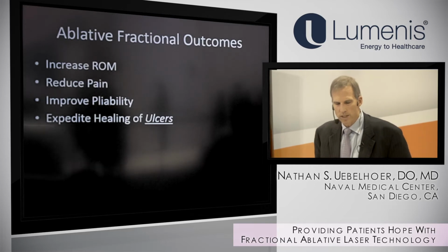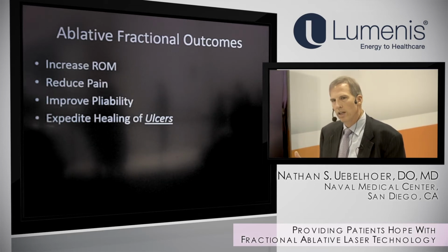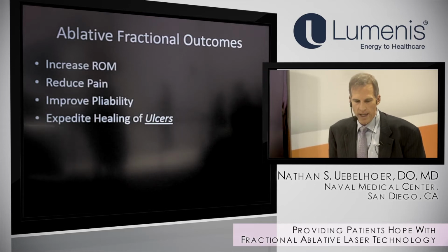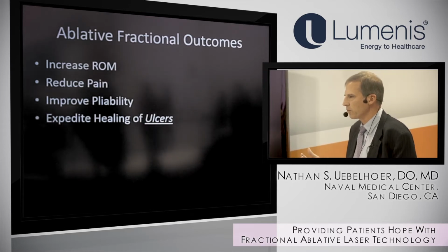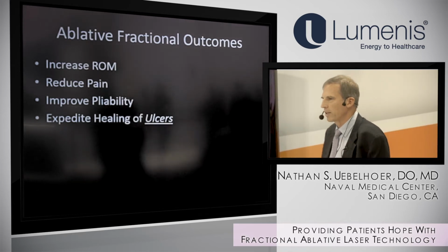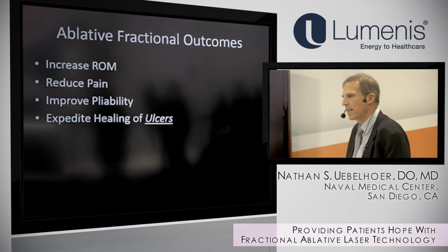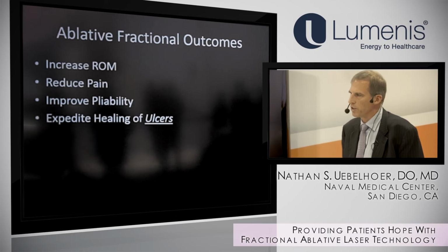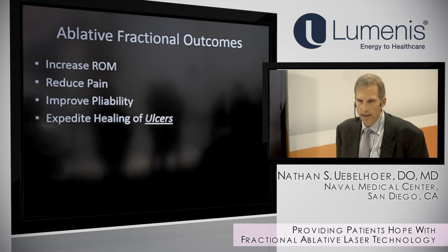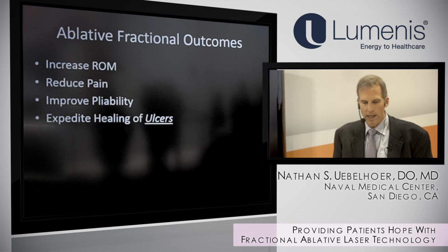So what outcomes are we looking for? The biggest improvement that we're so excited about is range of motion. We treat every scar that we see with this protocol, and a lot of them get some sort of increased range of motion, and you've seen some of these dramatic cases. Reduced pain is very frequent. We get a lot of patients who have pain in these scars, pain as they walk, pain as they do their activities of daily living, and the pain is often reduced. At worst, we get improved pliability. Almost all of our scars have had at least pliability improvement.